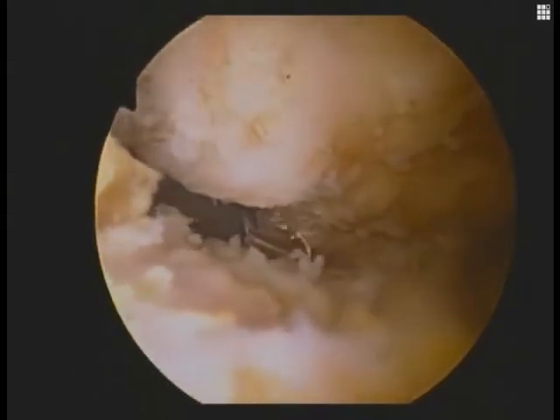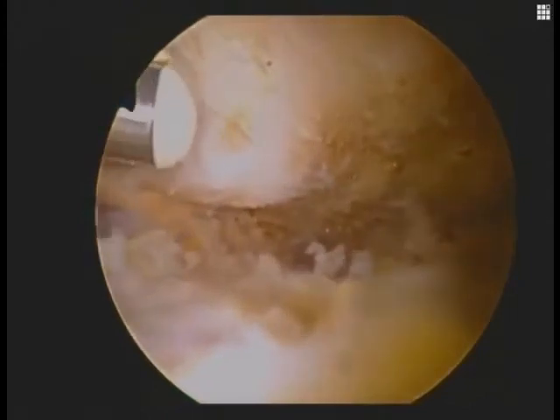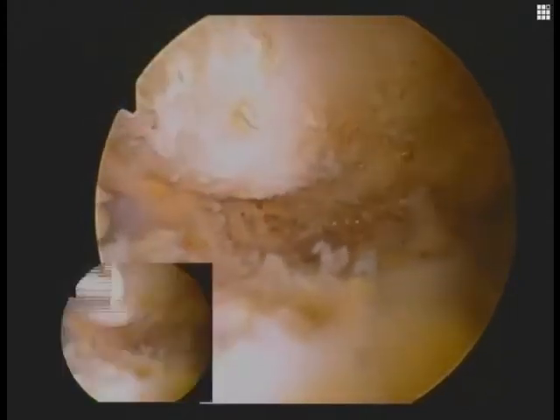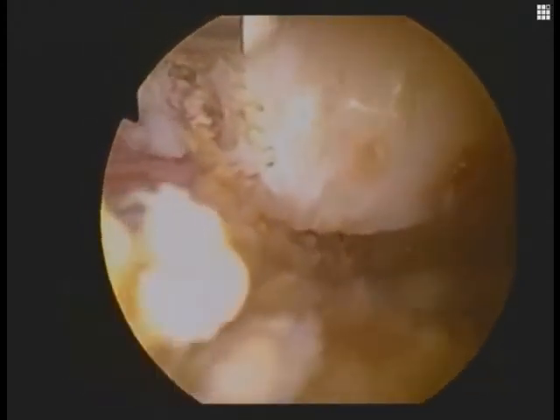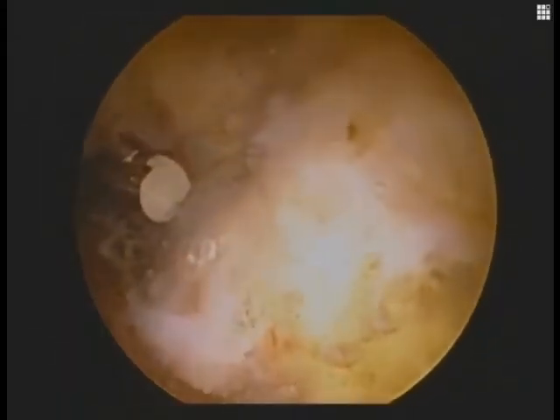We continue to remove the soft tissue above the supraspinatus and rotate our cuff medially under the lateral aspect of the clavicle. We've identified our AC joint, viewed posteriorly, looking superiorly up. We can see the cystic degenerative changes in the distal clavicle.